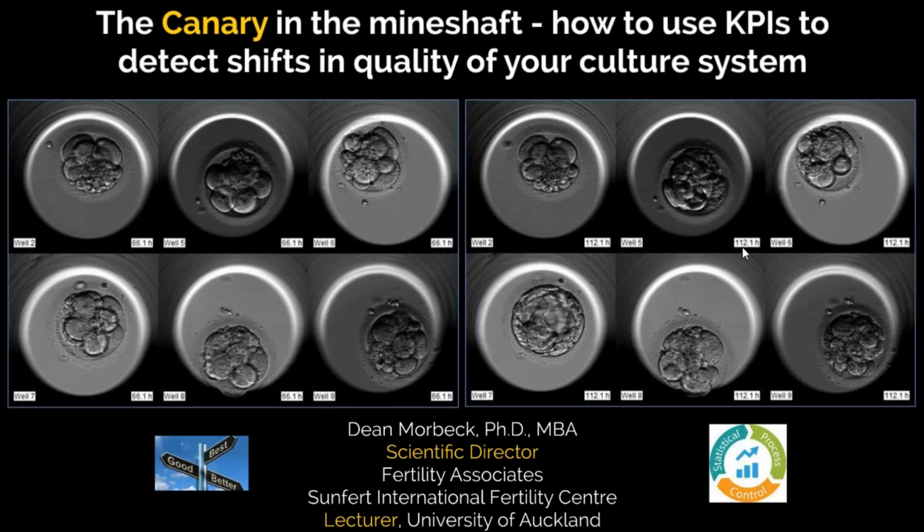A lot of different things could be involved in that. We happen to see slower growth with the change in culture media. It could be your culture media that's involved. It could be other components of your system. The fact that you hatch them on day 3 for biopsy, I presume, which we also do, we don't see a difference in our blast utilization with that. So I wouldn't say that that's the reason for that slower development, at least it's not in our hands.